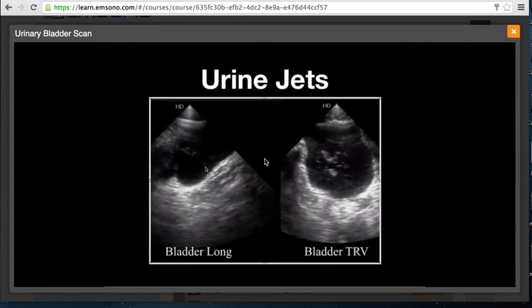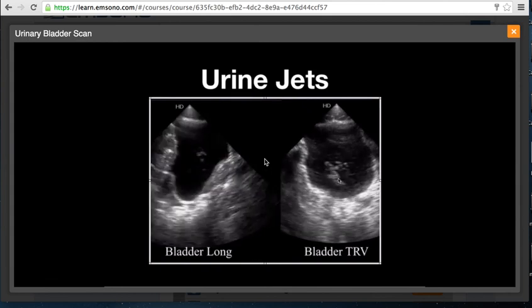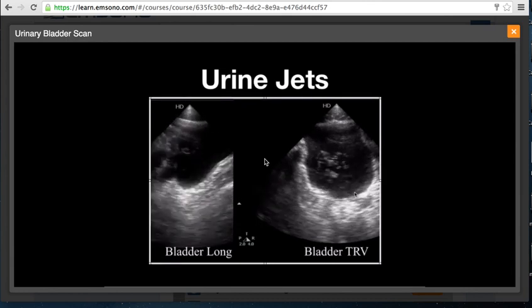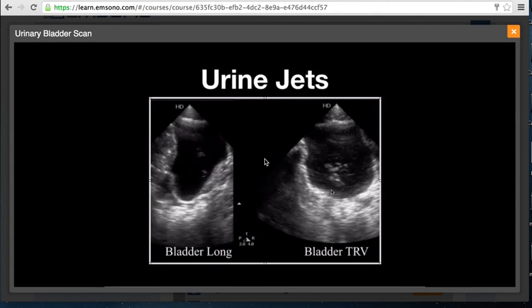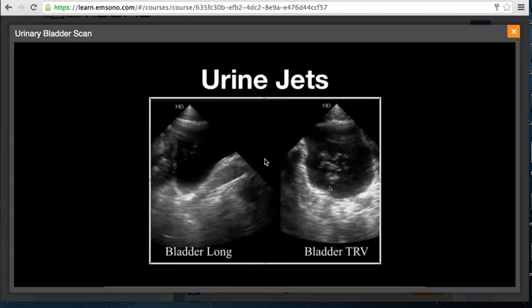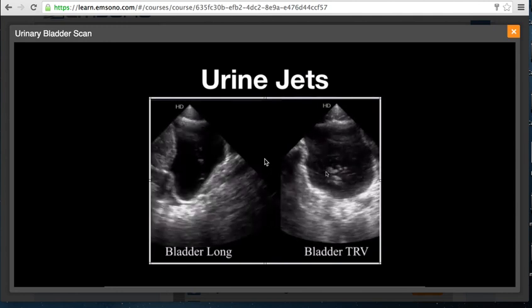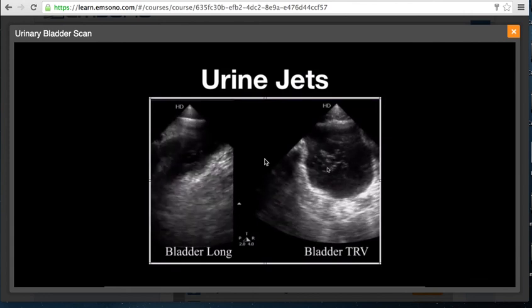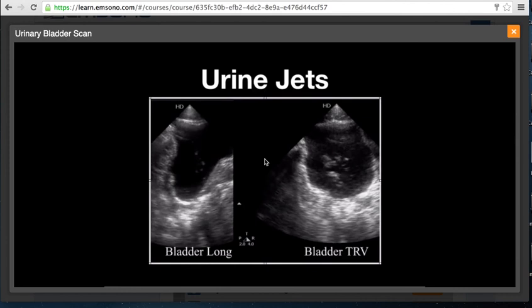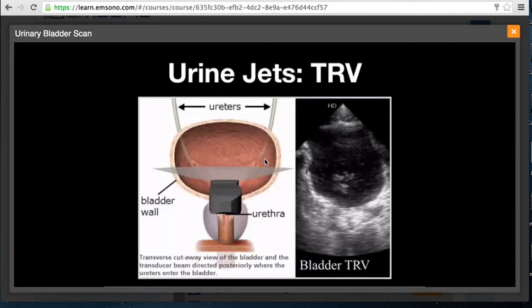Here is an example of urinary jets in both a sagittal view and a transverse view. Remember that the ureters enter the bladder posteriorly. Normally Doppler is used to visualize the urinary jets, but it's not uncommon to see them on grayscale imaging as well. This is simply urine entering the bladder from the ureters posteriorly. To obtain a urinary jet view in the transverse plane, position the transducer over the trigone posteriorly where the ureters enter the bladder in order to see where the urine is entering.